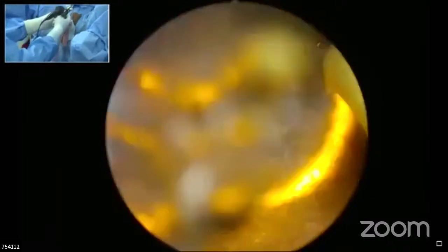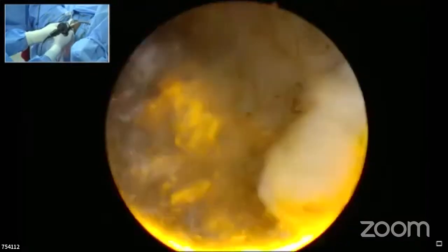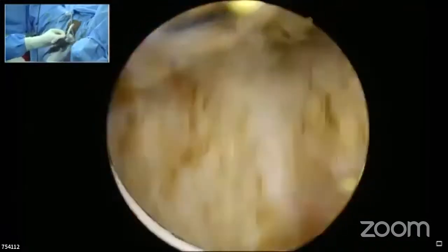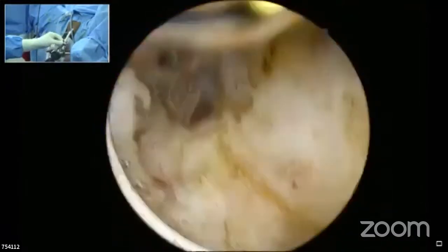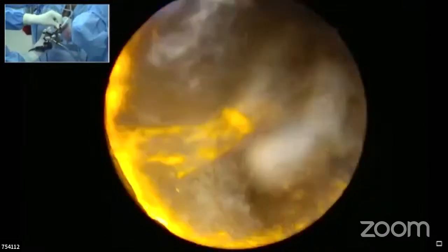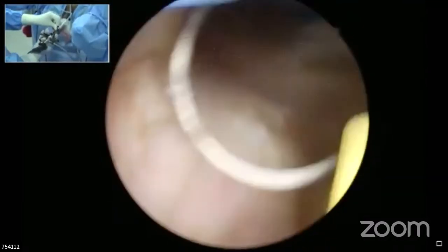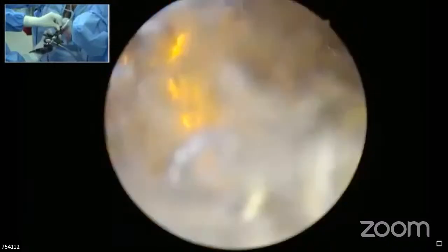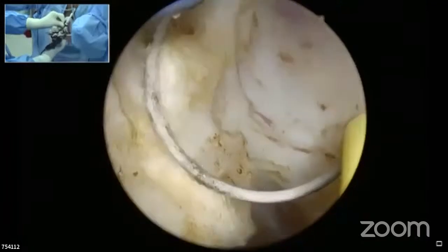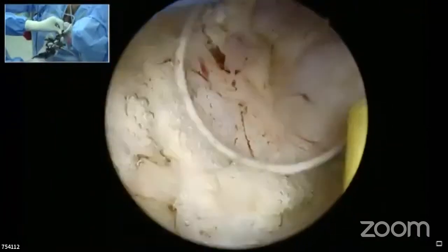There's another question. Is there any difference in doing a TUR immediately after acute retention or after 2 weeks once the inflammation is settled? That point is absolutely true, I think, because the majority of the times the retention is basically because of an infarct inside the prostate, and that produces a significant hypervascularity initially, which settles for a period of time. If you have done a resection immediately after day 1 after retention, you'll have a little more bleeding, whereas when you do a resection after 15 days on a catheter, it may be a different thing.